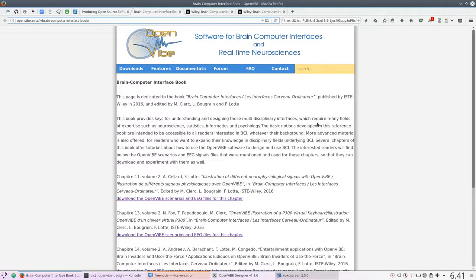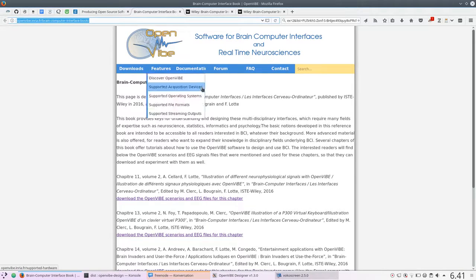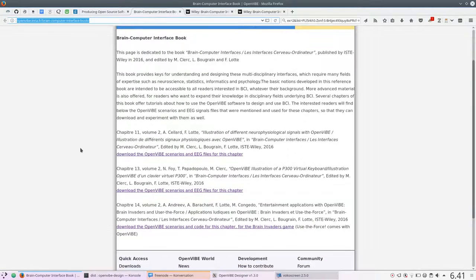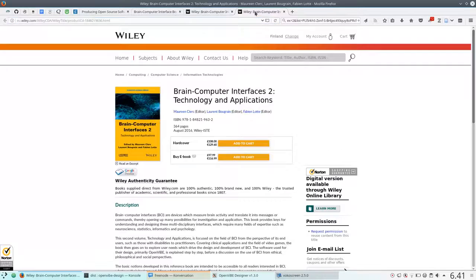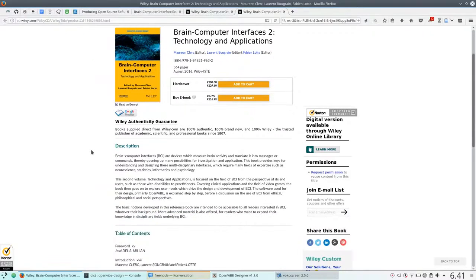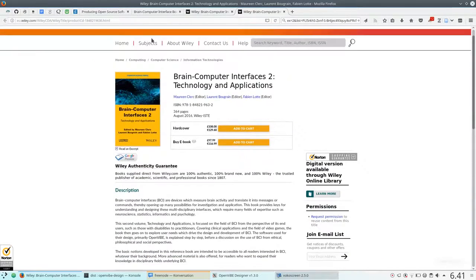The dataset I'm going to be loading today is freely available on the OpenVibe website. It comes from chapters 11, 13, and 14 of Brain-Computer Interfaces 2 published on Wiley, a very great book if you're interested in the field of Brain-Computer Interfaces.